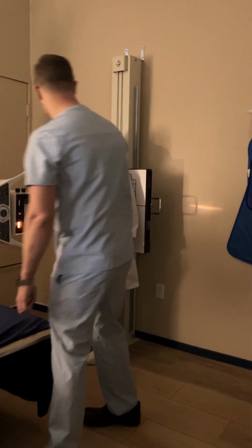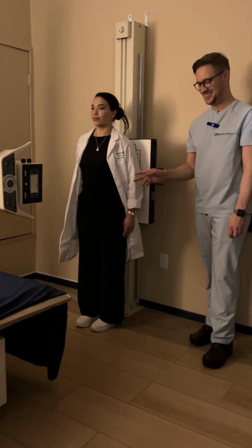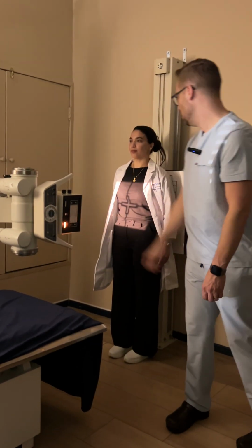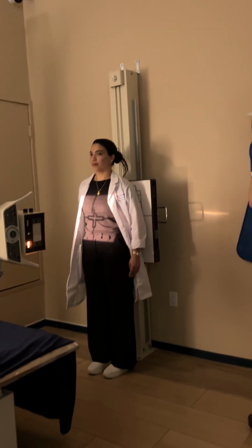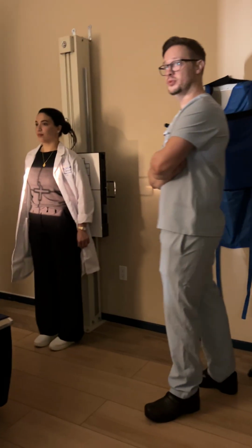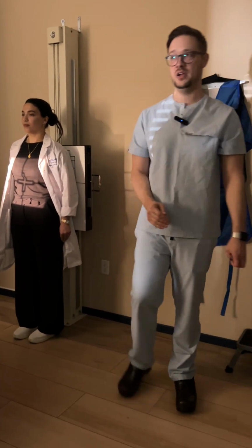All right, great. So we're centered at her MSP, 2 inches above the iliac crest. And now, what are our breathing instructions? Absolutely. Same as for a KUB. Same reason as for a KUB. Evaluation criteria for an upright abdomen is that we should see both domes of the diaphragms.